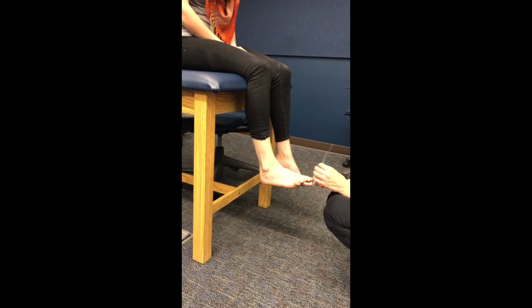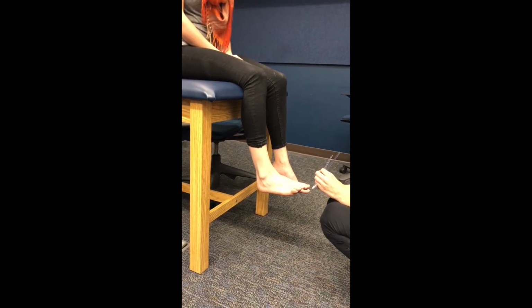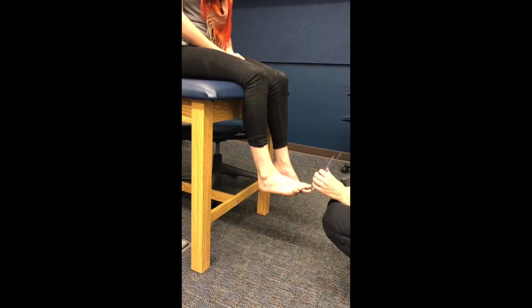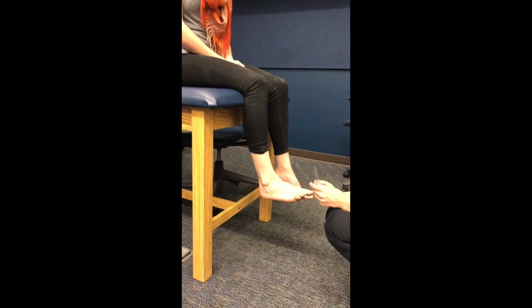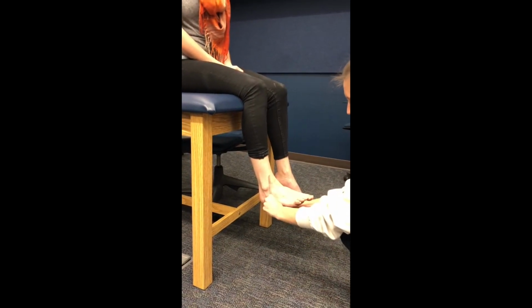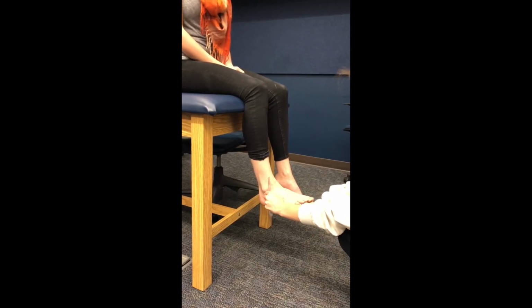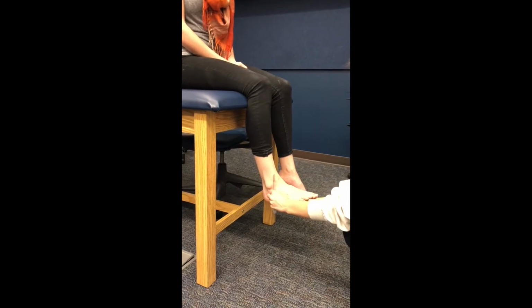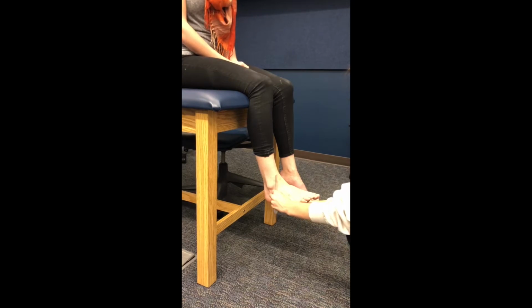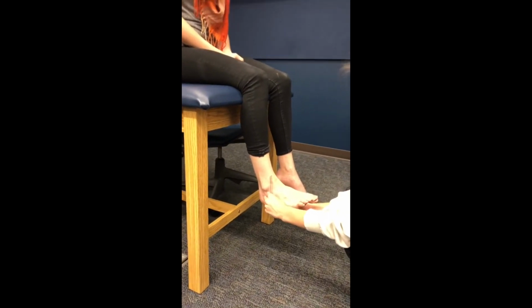Ankle inversion, 0 to 35 degrees. Position of the client, seated, knee flexed to 90 degrees, leg over the edge of supporting surface, ankle in 90-degree neutral position. Position of the goniometer, axis, lateral border of the foot near the heel. Stationary bar parallel to the longitudinal axis of the fibula on the lateral aspect of the leg. Movable bar parallel to the plantar surface of the heel. Measurement begins at 90 degrees. Subtract from total. Ask client to invert the foot.